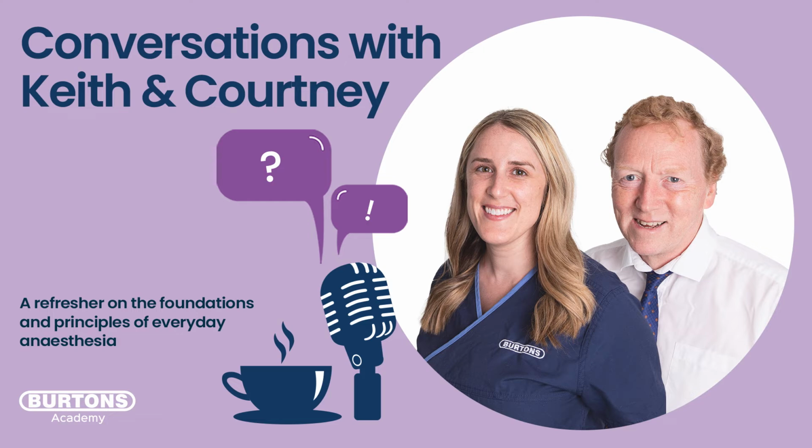Okay, so if we are talking about ventilation, we can assess patients' ventilation by looking at their capnography waveform? Absolutely, and that's the real window to what's going on. The efficiency of our ventilation is reflected by the end-tidal value. I always find the waveform quite interesting, and when I had to learn waveforms, I always tried to breathe with the patient and mimic what the waveform looked like. And I thought, oh gosh, I'm taking a lot of short, sharp breaths. Maybe that's how my patient is actually breathing.